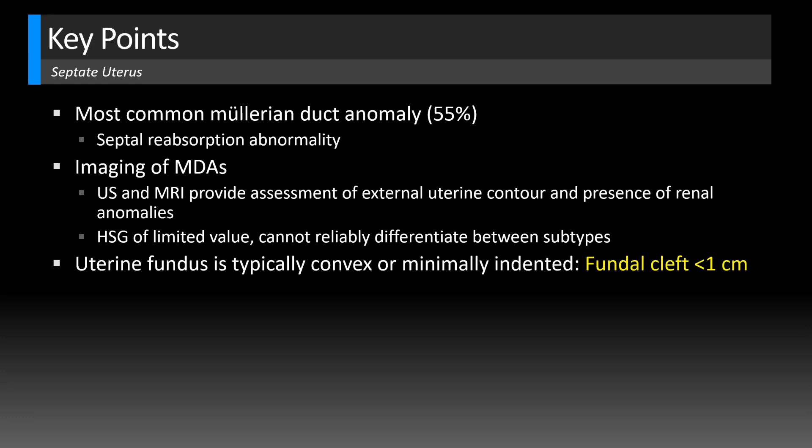With septate uterus, the fundus is usually convex — it may be minimally indented, but if there is a fundal cleft, it should be less than one centimeter. More than one centimeter should prompt consideration of bicornuate or didelphic uterus. That fundal cleft measurement has been found to be 100% sensitive and specific in differentiating these fusion abnormalities. You should always be skeptical of 100% claims, but the point is it's extremely accurate — as long as you have a nice coronal oblique view of that uterine fundal contour.